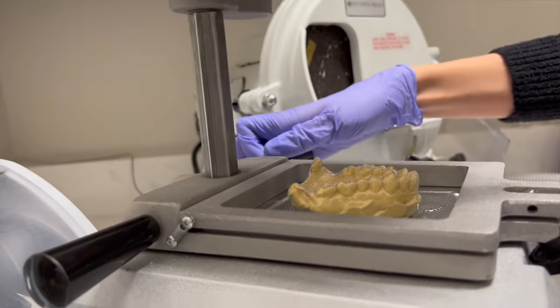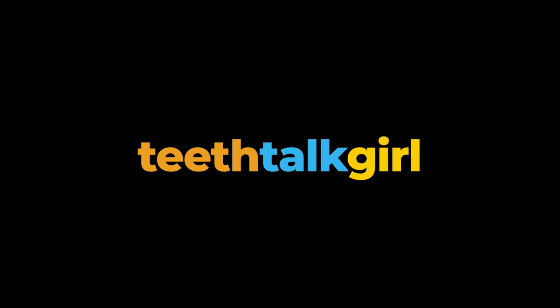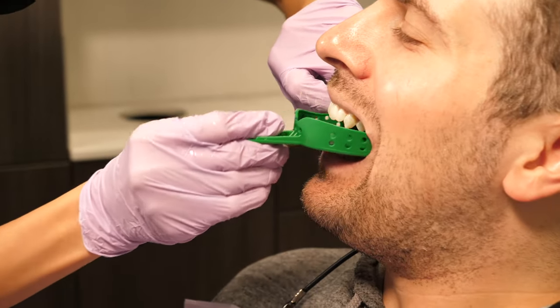How whitening trays are made at the dentist. First, they will find a tray size that fits your mouth.